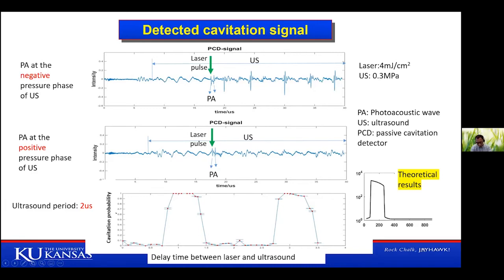So what we've done, they actually match very well. We pretty much see, not 100%, but they agree well with each other. So again, those basically all prove our hypothesis from the very beginning: laser plus ultrasound will enhance cavitation, and also laser plus ultrasound need to be synchronized properly in order to have this enhancement.